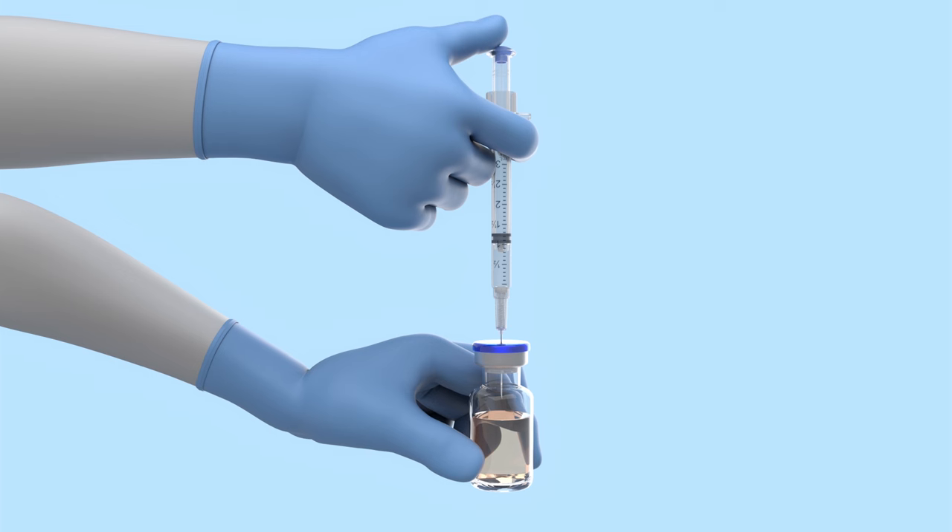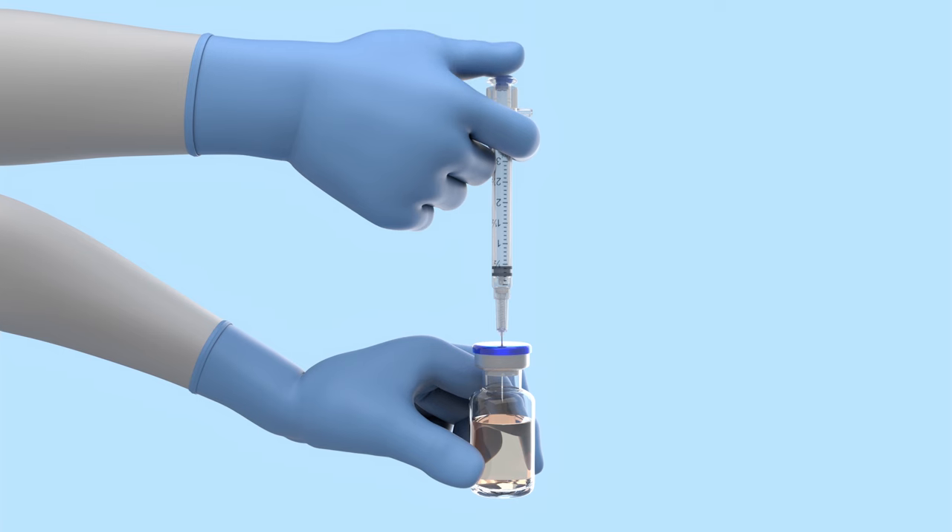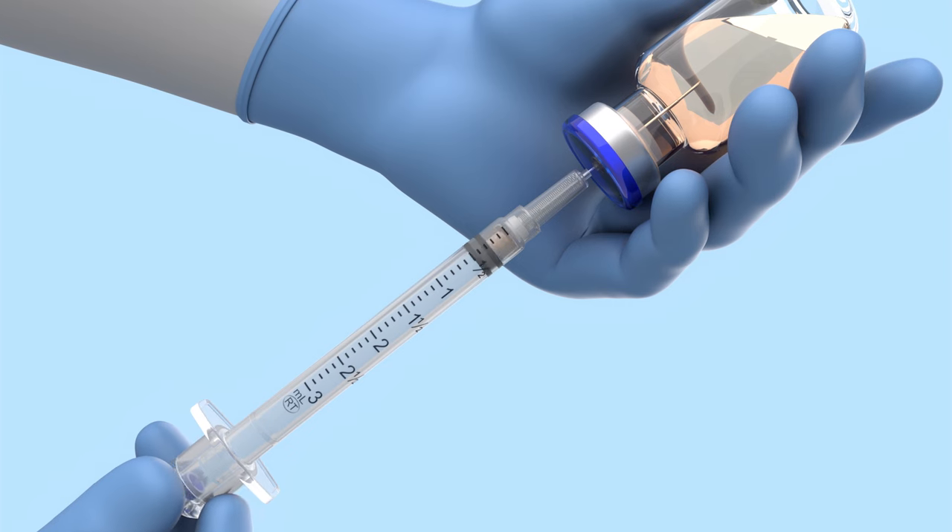Prepare medication using aseptic technique according to institutional policies. If injecting air into a vial, stop depressing the plunger handle at the resistance point. Draw up medication.